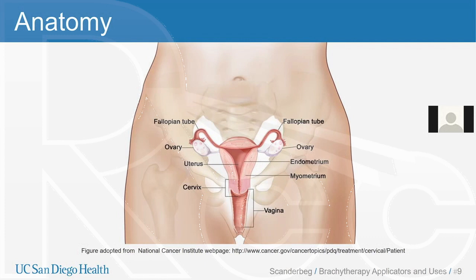The tandem will run the entire length of the uterus from the cervix to the fundus. It's important to note that the uterus is also a muscle and that the tandem can be sharp enough to puncture the fundus if enough pressure is applied during the insertion. So it's important to note the position of the end of the tandem in relation to the fundus. Care must be taken to not load a tandem that has perforated the uterus.